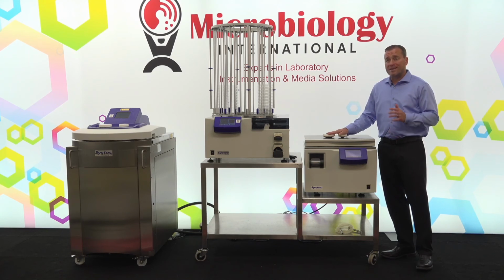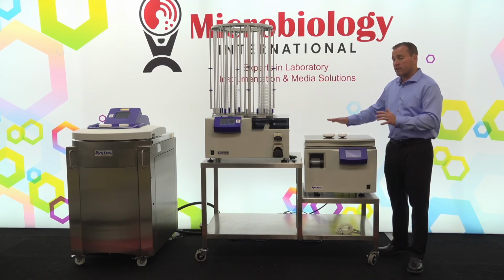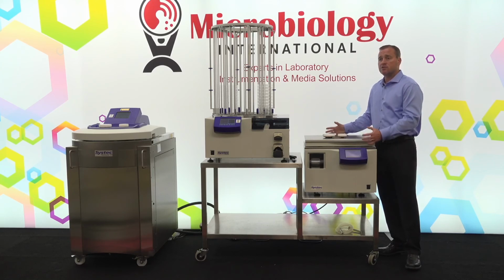We do recommend a yearly PM for all of these. We do have our own service organization that would be providing that preventive maintenance service. That would include calibration of all of the probes in here and pressure transducers, as well as new gaskets, and just make sure that everything is working well inside of the instrument.